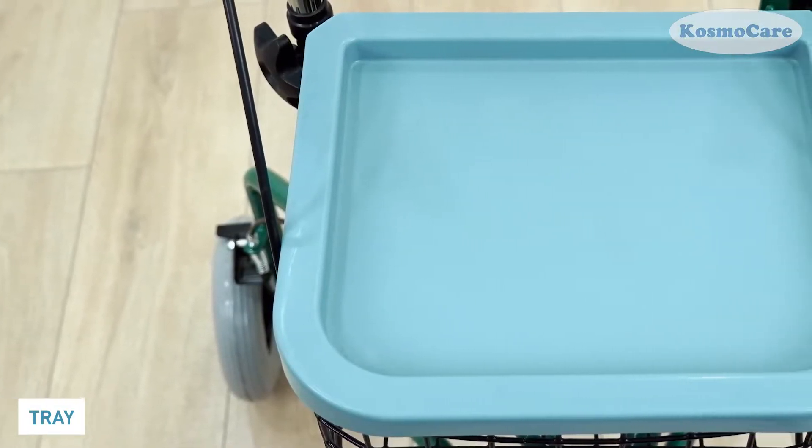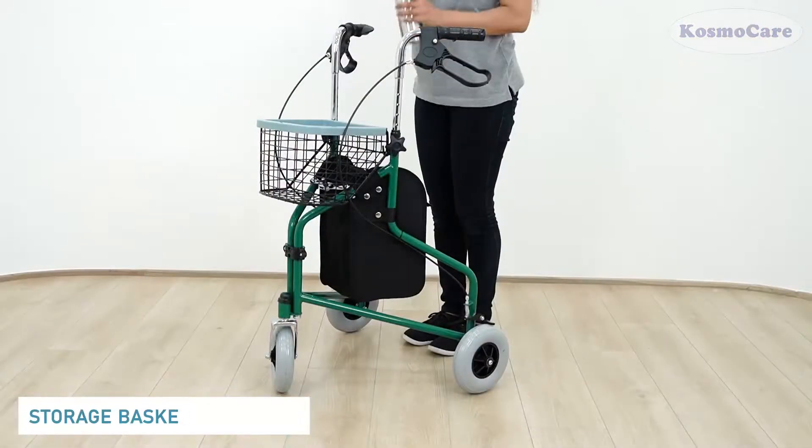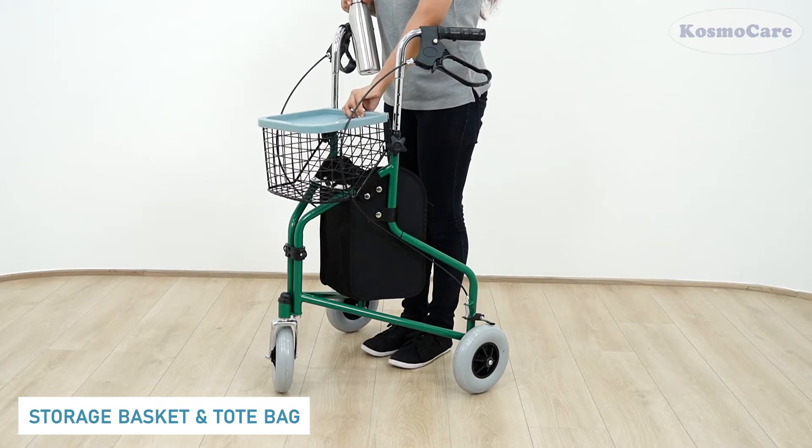The tray assists you to keep food, beverages, or any other object. A storage basket and tote bag are included to store your essentials.